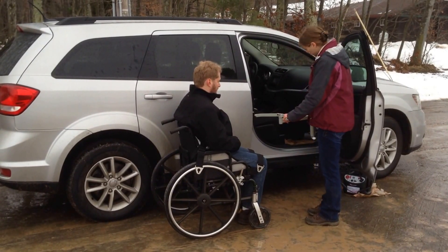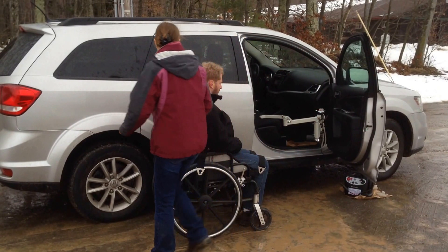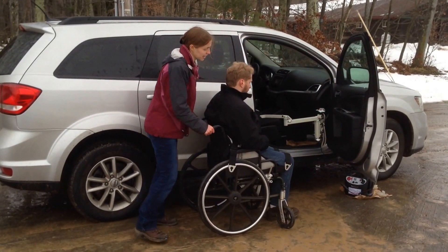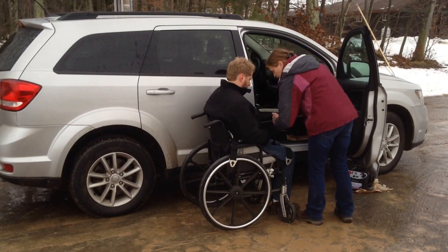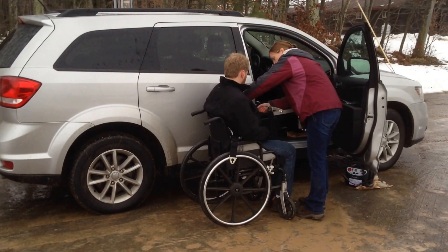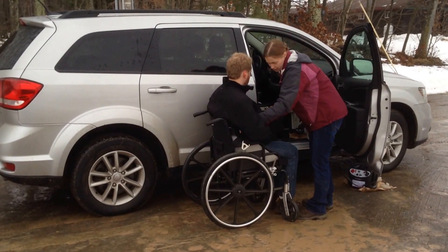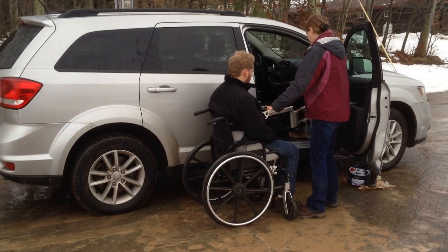I'm going to lower the lift to the bottom and move the user into position. Our no-lift sling has been placed ahead of time. For more information on that, please visit us at youtube.com/accessun and search sling placement. I connect the leg tabs to the center button and the arm tabs to right and left, and he's ready to lift.